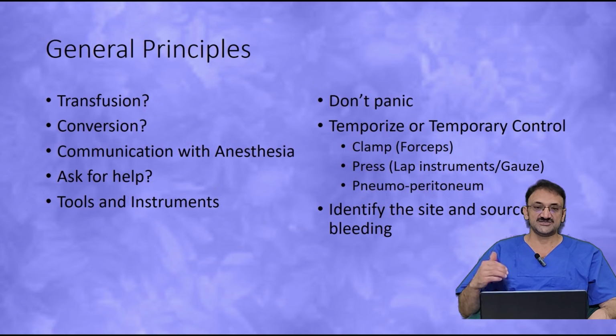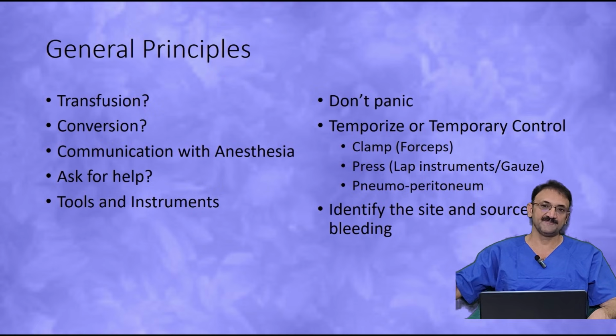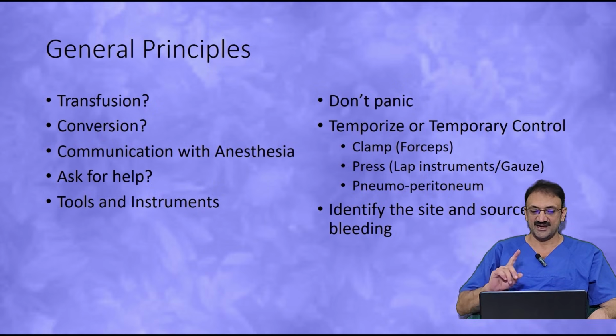Even then, the trolley must be present. It should not be present in the sterilization department. It should not be present in the room next door to the OT. No, it has to be open. And all the instruments, including the retractors, the vascular clamps, the suction device, the open diathermy tools, all have to be present in the room, and the scrub nurse has to be present there.